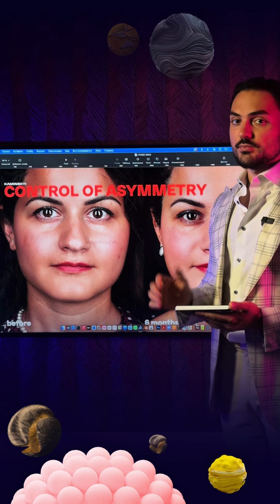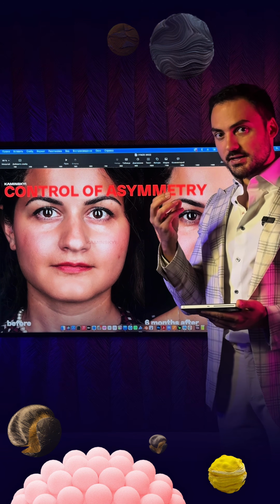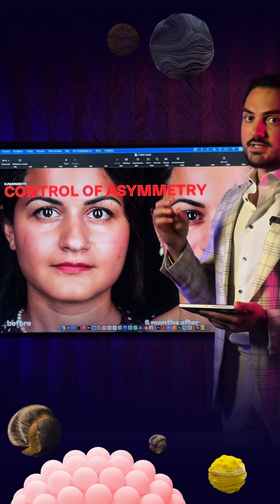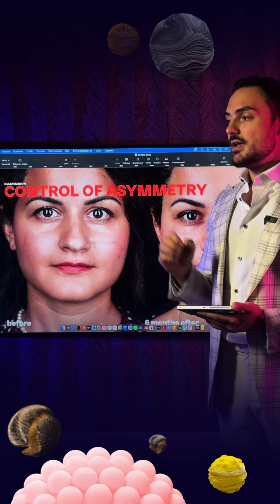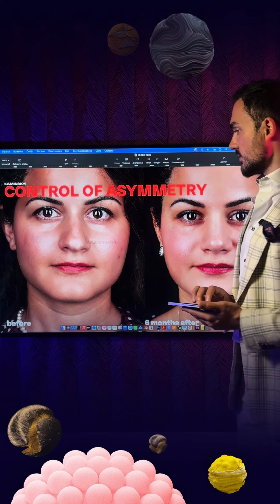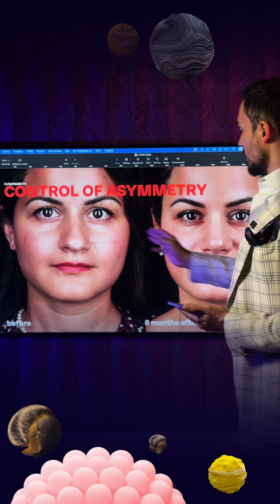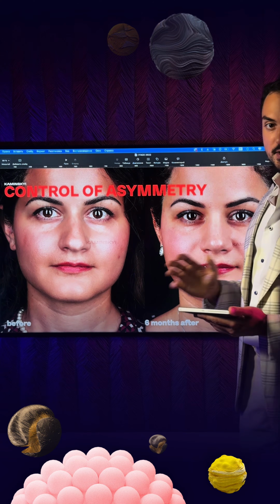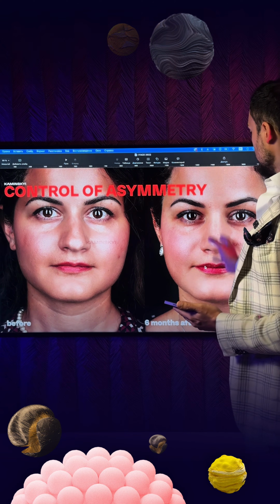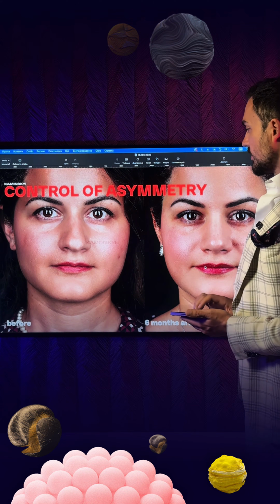And this is an example of how ultrasound examination helps us to understand why we have asymmetry after the rhinoplasty and how we can do the correction of the rhinoplasty after the surgery. So this is the result before and after. We can compare two noses. It seems like okay, a nice beautiful nose, new beautiful shapes, lights on the tip of the nose.